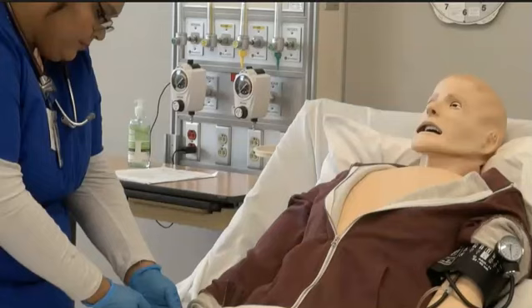Notice how the respiratory therapist continues to communicate with the patient.